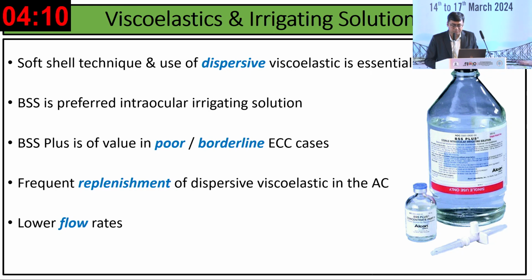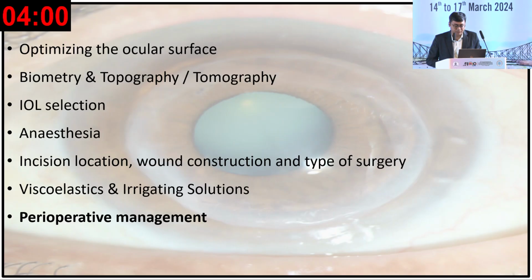Keep on replenishing the dispersive viscoelastic. Don't be shy. You can use an entire syringe if you want to, and lower the flow rates. Do a slow phaco when tackling such cases.